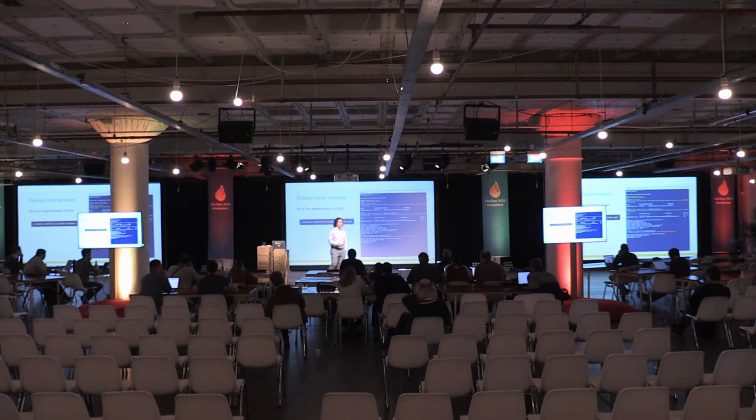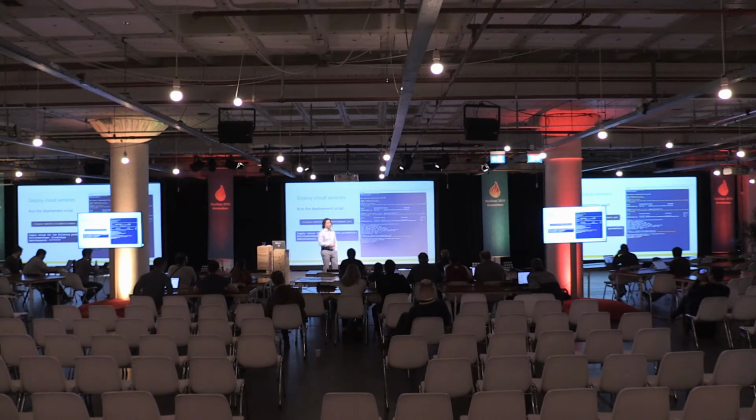All right, and now we're actually going to deploy the cloud services. So this is just one script that you run. The way you run it is ./create-IoMT-FHIR-cloud-environment.ps1. So you're going to go ahead and type that in, hit enter, and then it's going to ask you for 2 parameters.